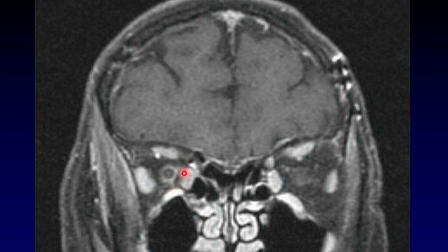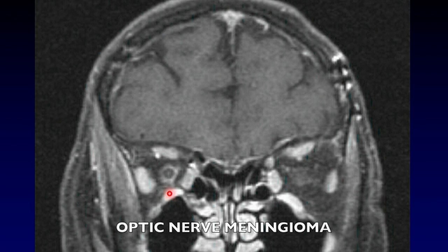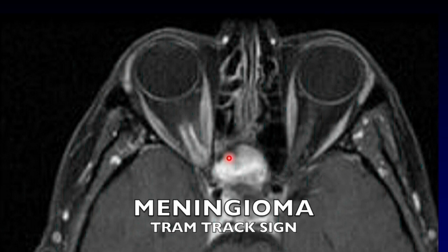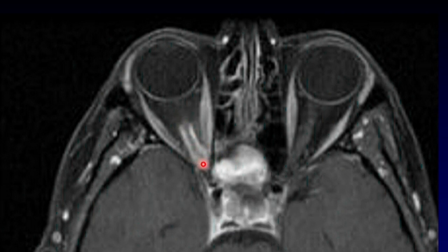Contrast that with this image. Here there is a preserved dark nerve centrally, and the enhancement is all around peripherally, somewhat poorly defined. This is characteristic of an optic nerve sheath meningioma — it's arising around the nerve, not in the nerve. Sometimes it can compress the nerve quite a bit. In the axial image, we can again see the preserved nerve down the center and the enhancing tumor on either side — these are the tram tracks.